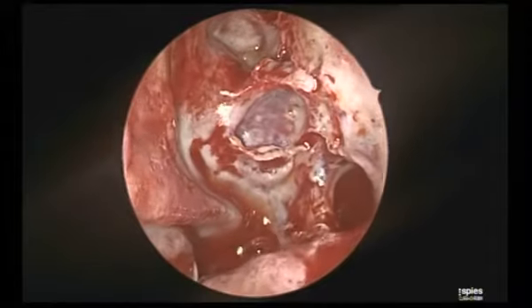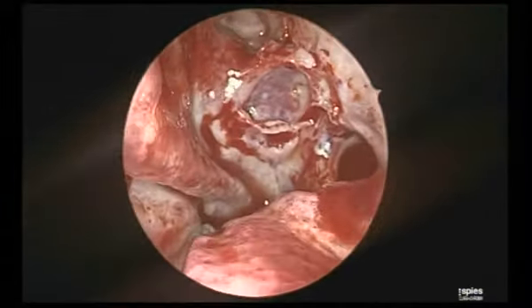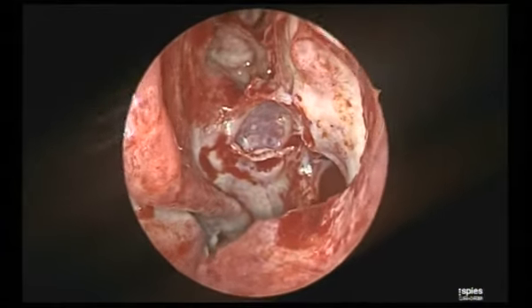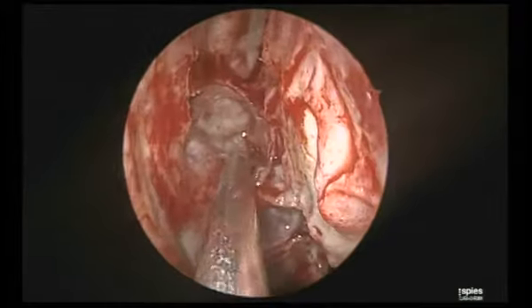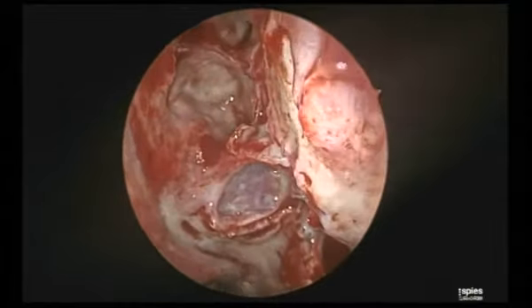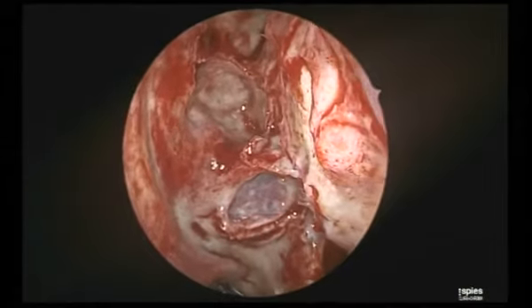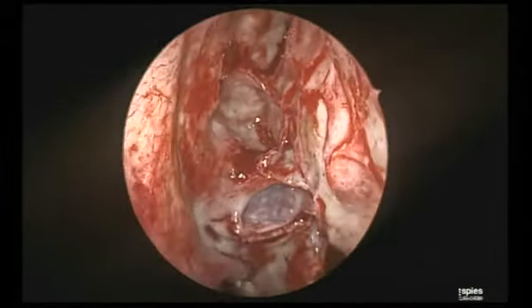So now what you see, the next structure in front of you after removal of the bulla, is the ground lamella. We went in the retrobullar recess and got the bulla out, the same way going behind it, got it out and saw the anterior ethmoidal artery behind. Okay, this is the anterior ethmoidal artery. I will reiterate to my junior colleagues 100 times, the best way to identify the anterior ethmoidal artery in a difficult situation is what I am going to tell you.